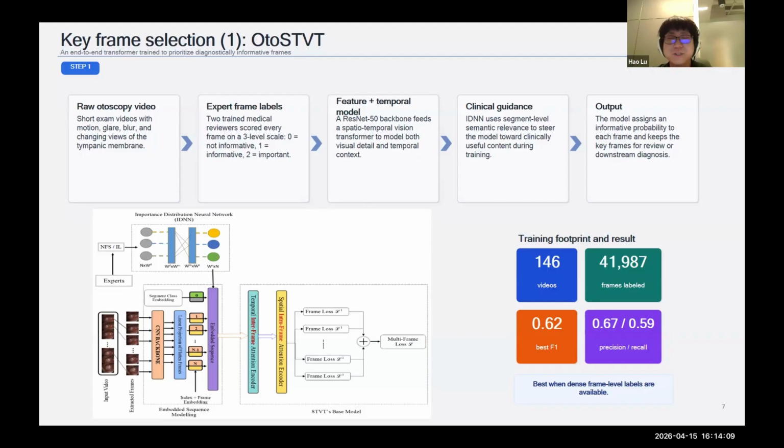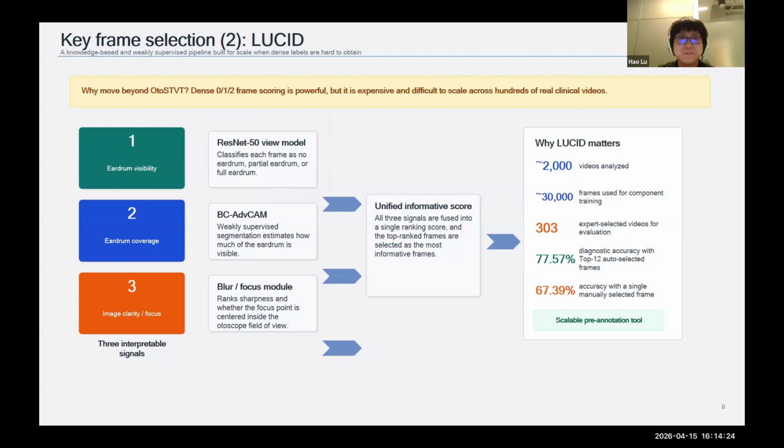We do a lot of experiments, comparing our method with all the existing video summarization methods, and this is the best. However, as I mentioned, the end-to-end trained deep learning model doesn't work that stable. But if we want to use it in a real clinic application, stability is the most important. We don't want to say, okay, for this patient, we can have a very good diagnosis. For another patient, it immediately becomes bad.